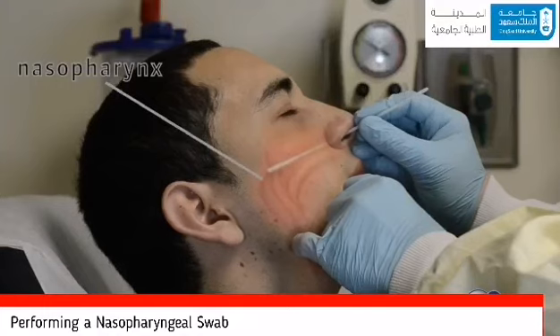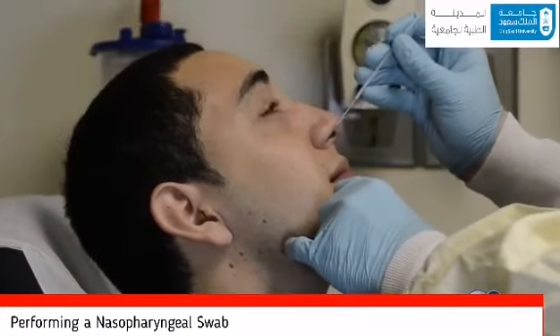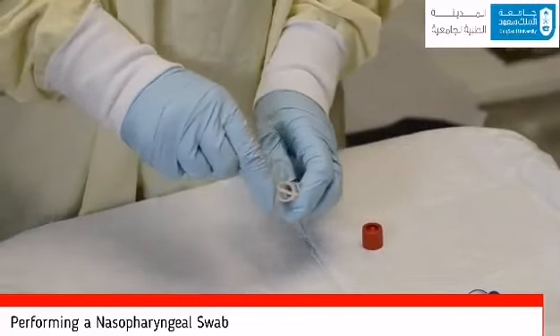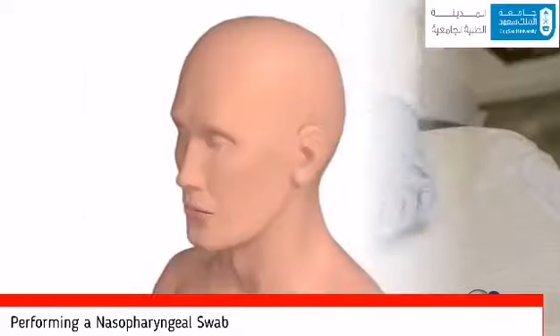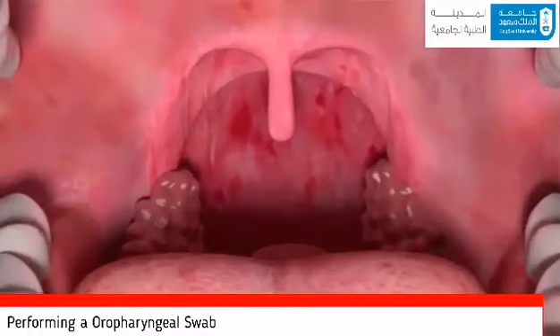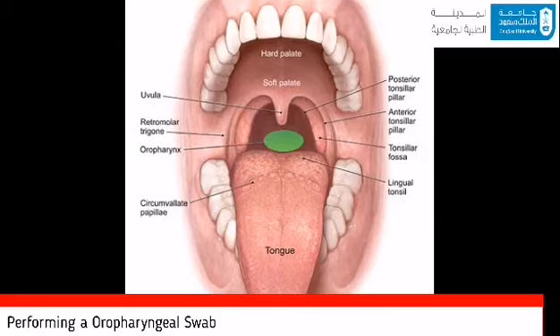Rotate the swab several times. Gently remove the swab and place in the viral transport media. After collecting sample from the nasopharynx, prepare to collect oropharyngeal sample next. Oropharynx is located directly behind the mouth. Sample is obtained by directly inserting the swab into the posterior pharynx. Rub swab over both tonsillar pillars and posterior oropharynx and avoid touching the tongue, teeth, and gums.